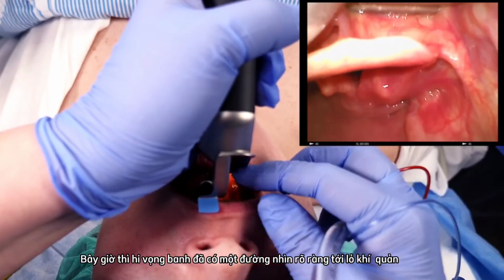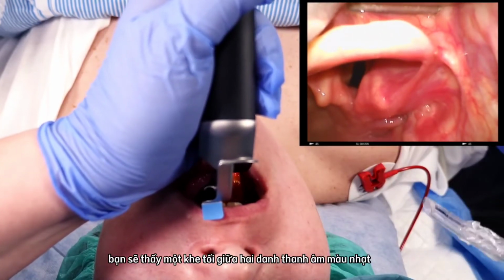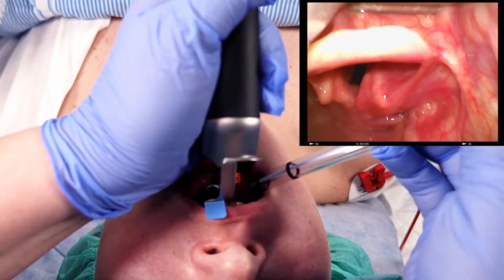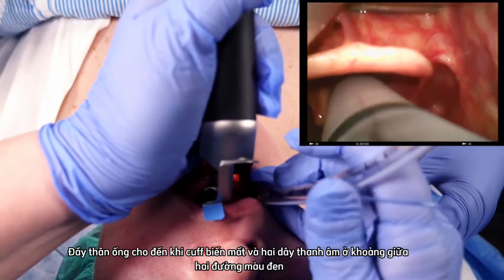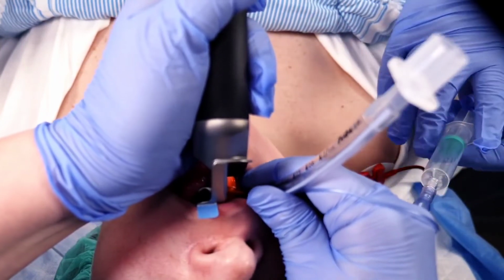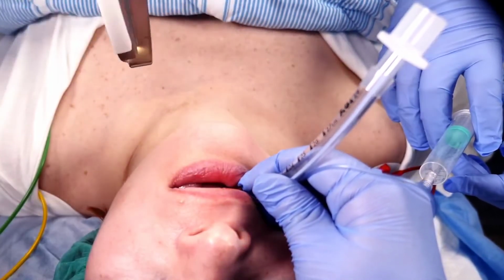By now, you hopefully have a clear view of the opening of the trachea, a dark slit between the pale vocal cords. Insert the tube carefully. Sometimes a gentle rotation is required to pass the vocal cords. Advance the tip until the cuff has disappeared and the vocal cords are between the 2 black lines. Ask for inflation of the cuff and carefully retract the laryngoscope.